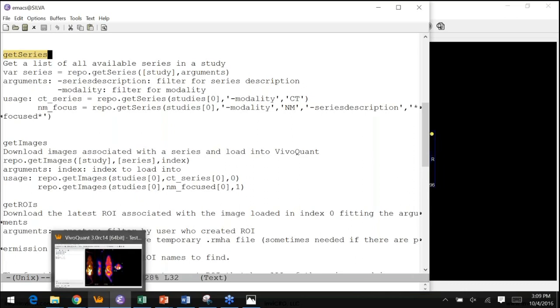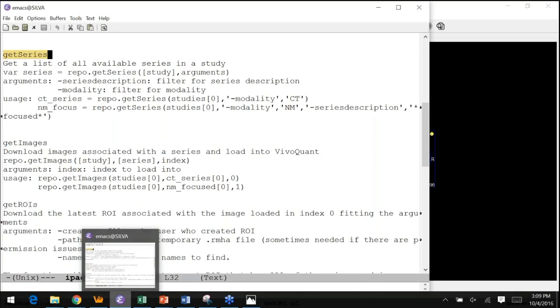This is, for instance, great for CT images, where you then just specify projects, and then you go through all the CT images, load them, save QC images somewhere, and even push them back to the IPACS, store files on the web disk or in a local drive, and then go through all the images generated from the projects. This is something that we use a lot in our day-to-day work. Exactly. Yeah. Great. All right. Thank you.